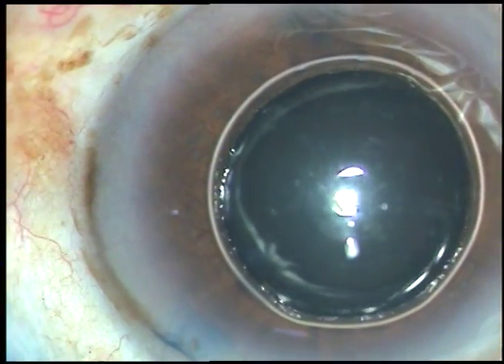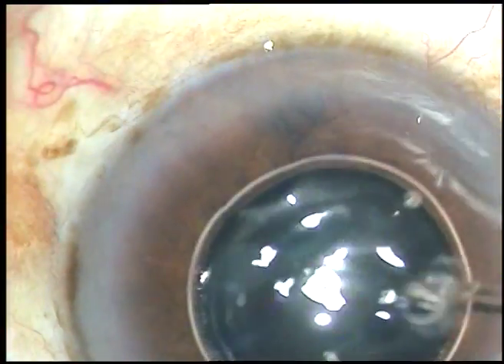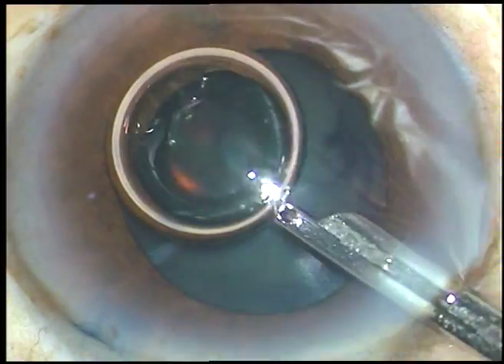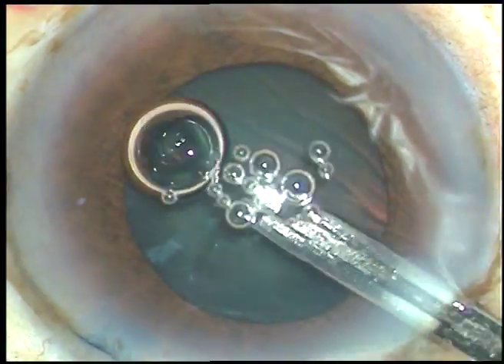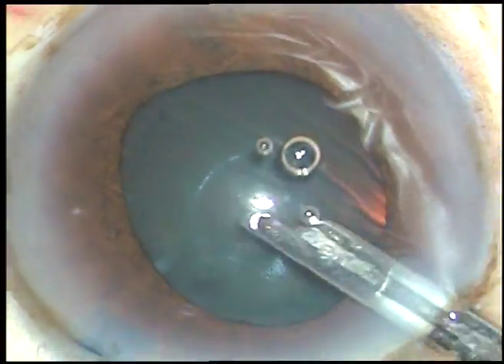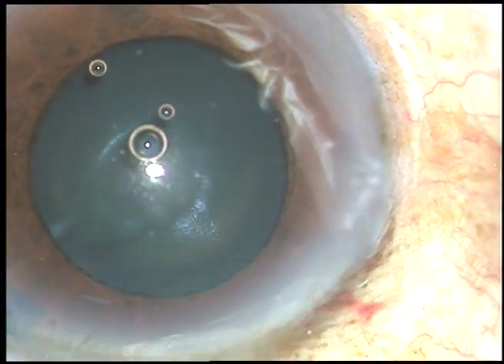Now I am injecting a little bit of adrenaline to see if the pupil dilates a little more. And yes, after washing the dye out of the anterior chamber, I can see that the pupil has dilated a little more, and this will help me a lot in doing capsulorhexis.